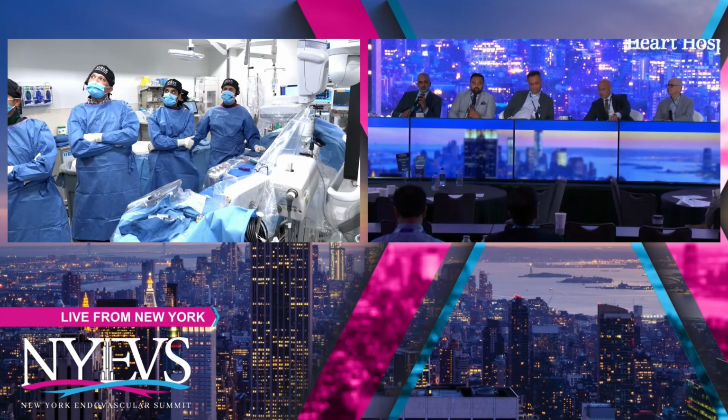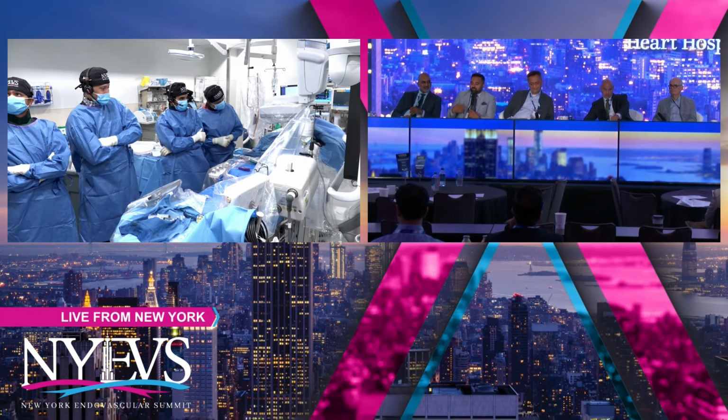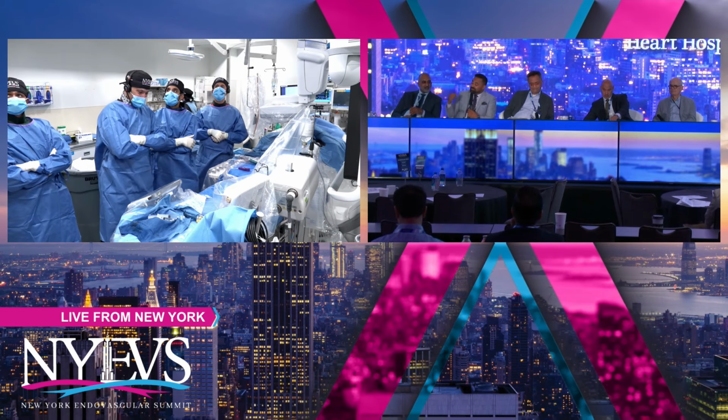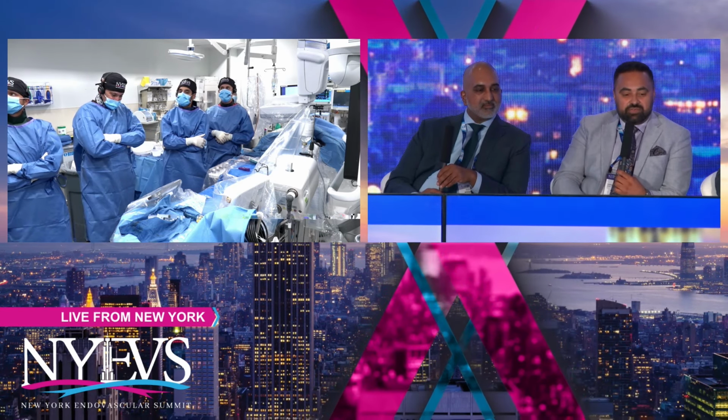Hey guys, this is Kumar. I think having you three in one case scares the hell out of me, but I think 8 French for Rotarex makes sense if that's what you use. I agree with George's question about the iliac stents. That makes me always concerned about when you're putting things through there and coming back.